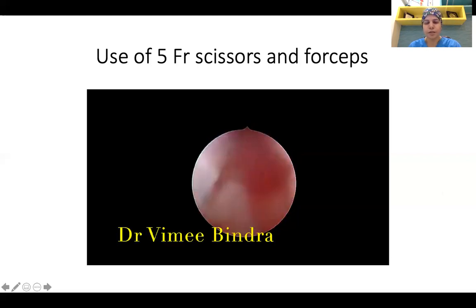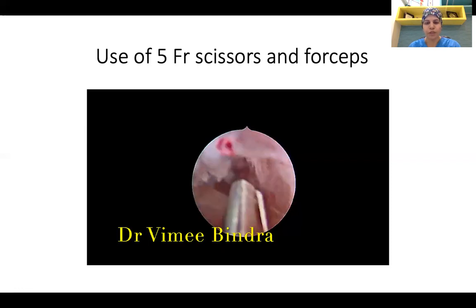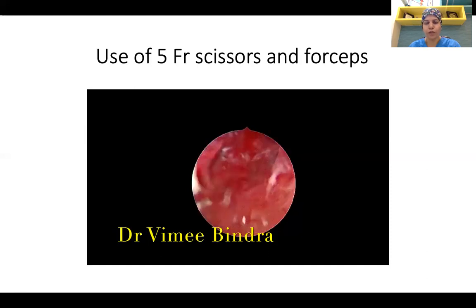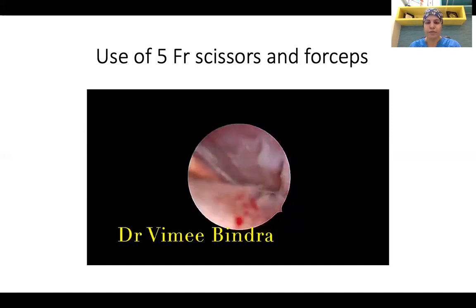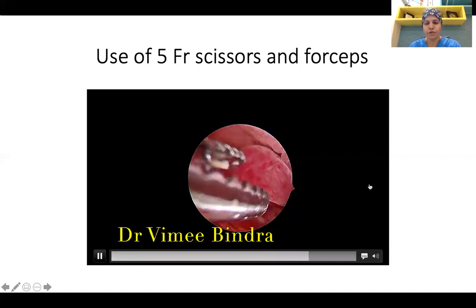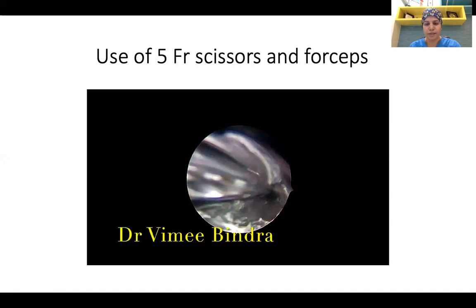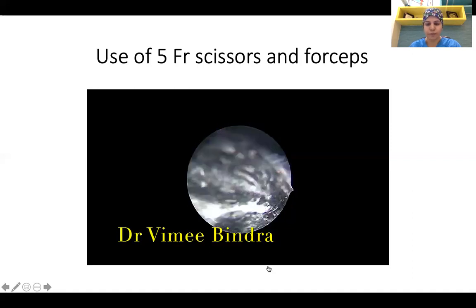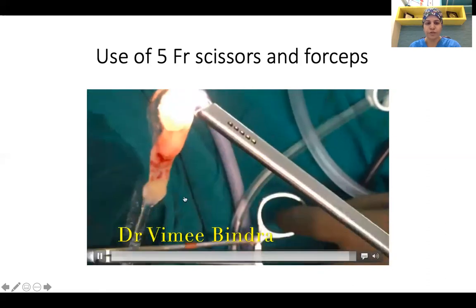Cold scissors is a very useful tool. You can start detaching the RPOC from its attachment to the uterine wall. There is no curettage to the other walls, no damage to the myometrium, and you can use a simple 5 French forceps to remove the RPOC — the procedure can be completed in the outpatient setting. Using these forceps, there is no need for any active electrode in most cases. This is the RPOC removed with the hysteroscope, and the procedure was completed in a single setting.